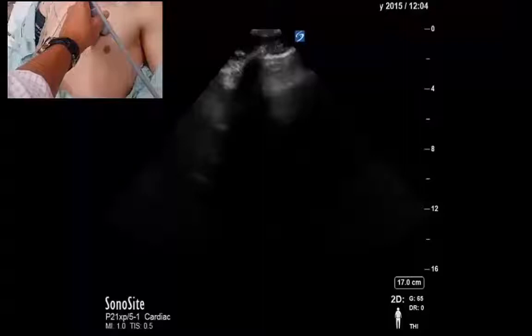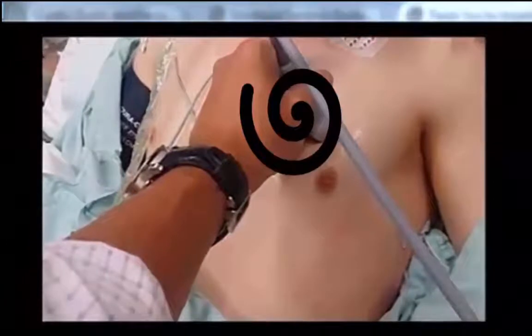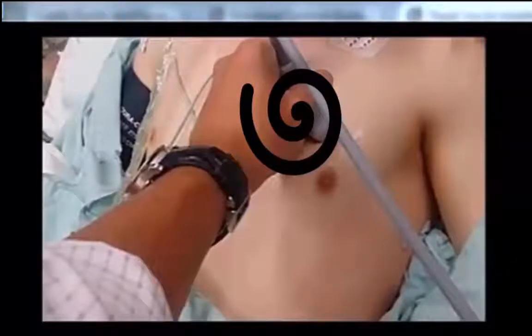I'm going to show you what I do for the parasternal windows. It's a simple method of running the probe in a sort of snail shell — gradually increasing radial circles from my initial starting point — all the while looking at the screen for the sudden flash of an acoustic window or the presence of a heart.